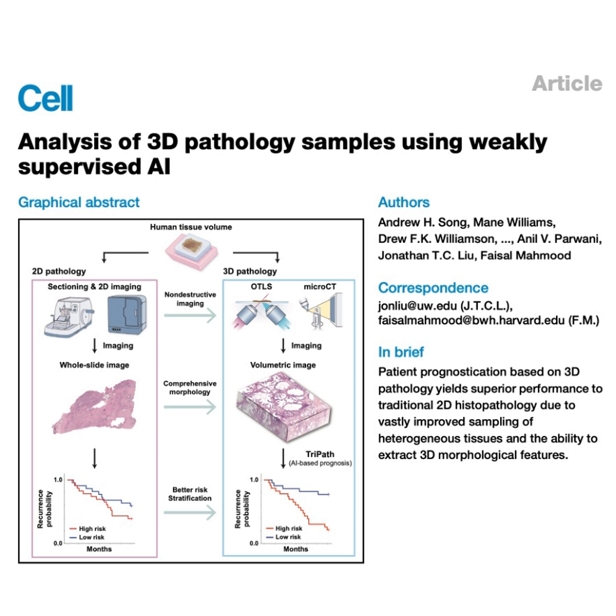And crucially, it outperforms not just 2D methods, but also expert human pathologists, even when they have way more data than usual, likely because it can process that complex 3D information more effectively. That's a great summary. And it's interpretable. It learns to identify known high-risk 3D features, confirming its clinical relevance, and this ability seems to generalize across different imaging types. Absolutely. And thinking about where this could go clinically is maybe the most exciting part.